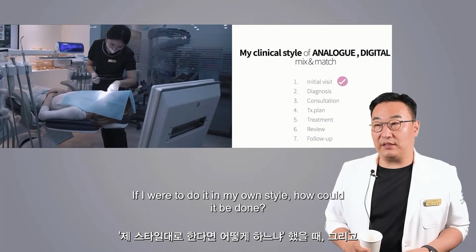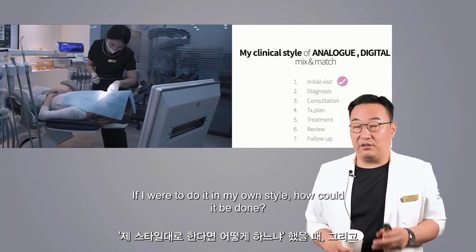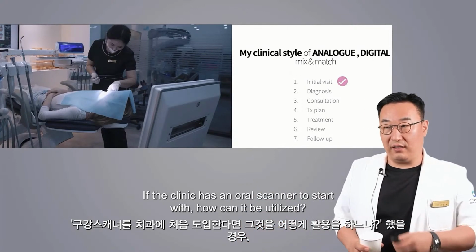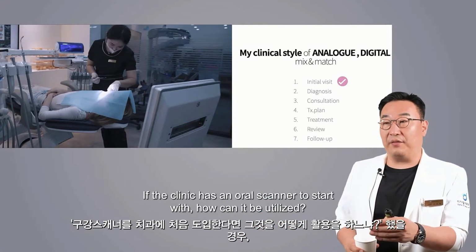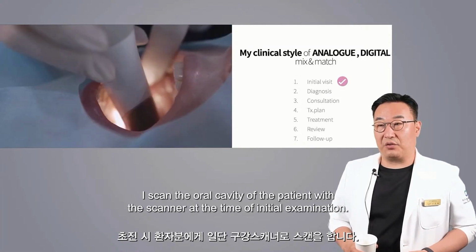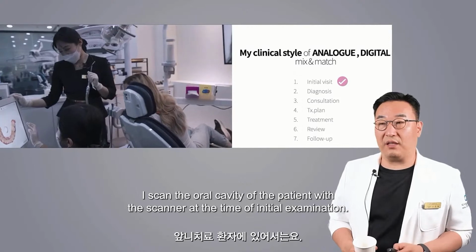If I were to do it in my own style, how could it be done? If the clinic has an oral scanner to start with, how can it be utilized? I scan the oral cavity of the patient with the scanner at the time of initial examination.